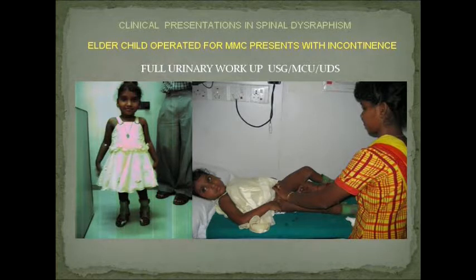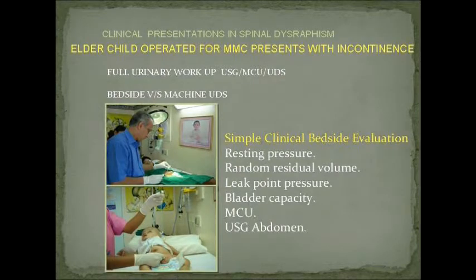will need a full urinary workup. When we say full urinary workup, we don't dispute the need for USG and MCU. As far as urodynamic studies are concerned, we've heard a lot since morning, and I want to say just one thing: a lot of urodynamics is still an art.